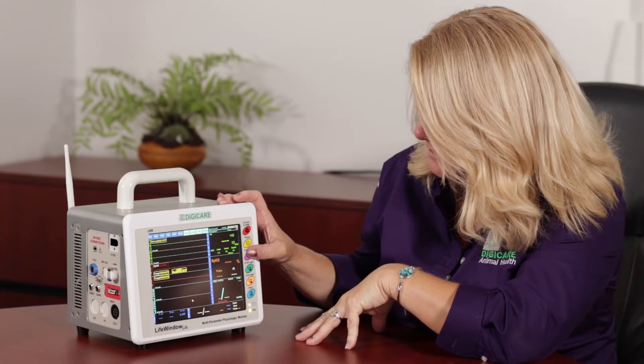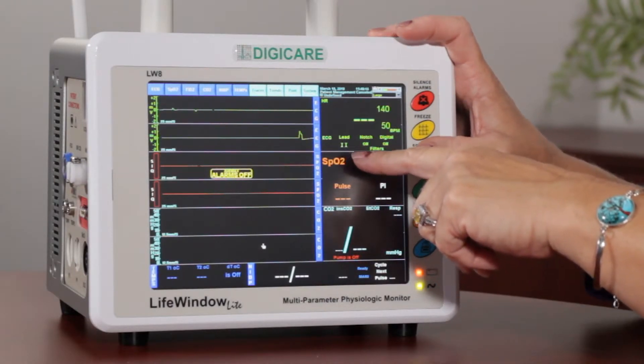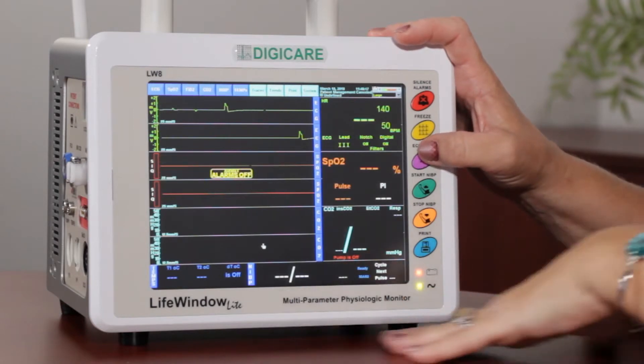We have the ECG lead, so you can toggle in between leads 1, 2, and 3. Each one of these leads looks at the heart at a different angle.